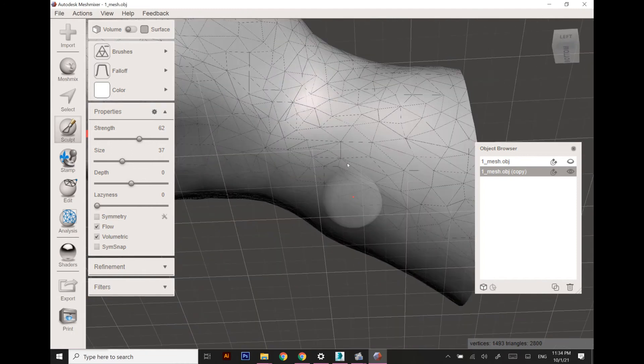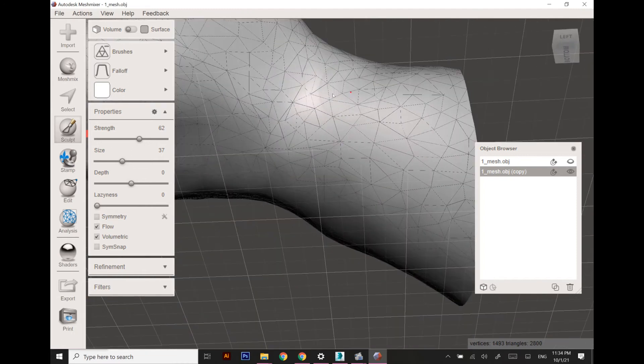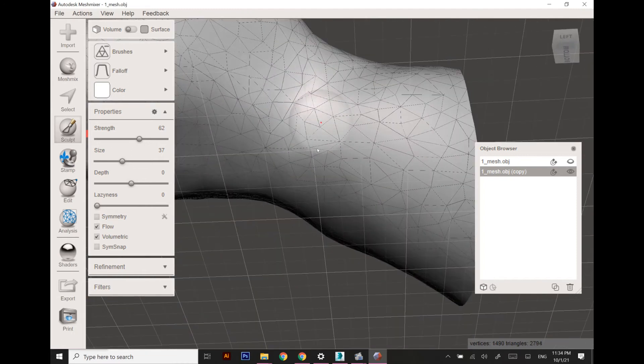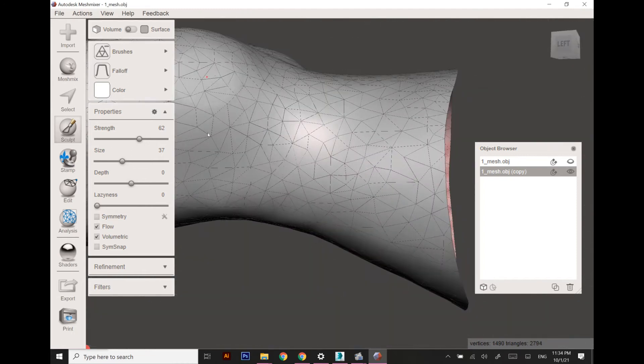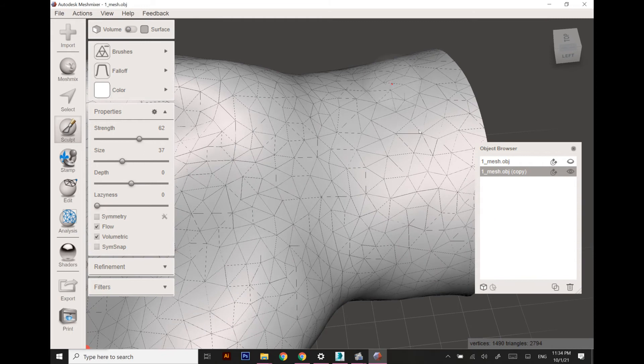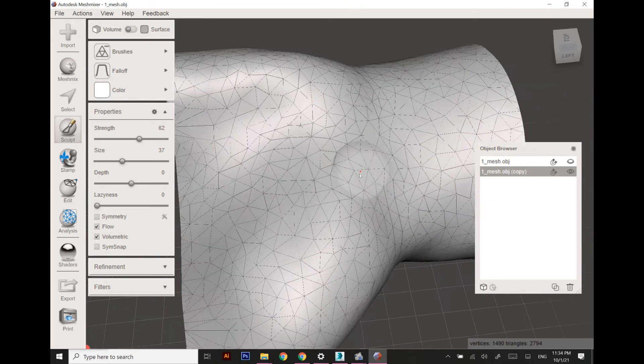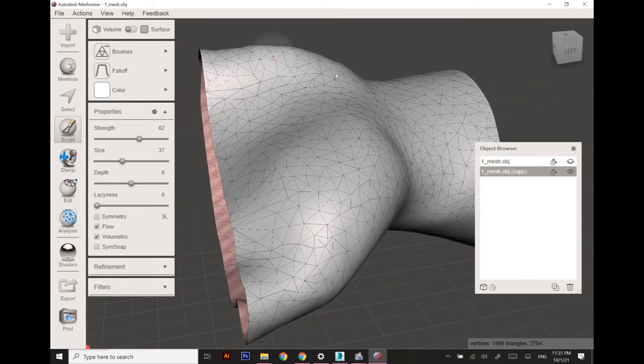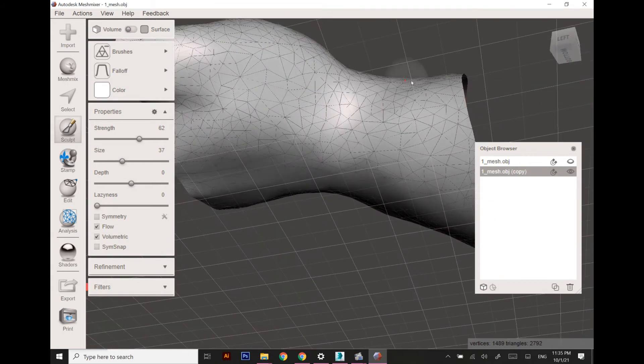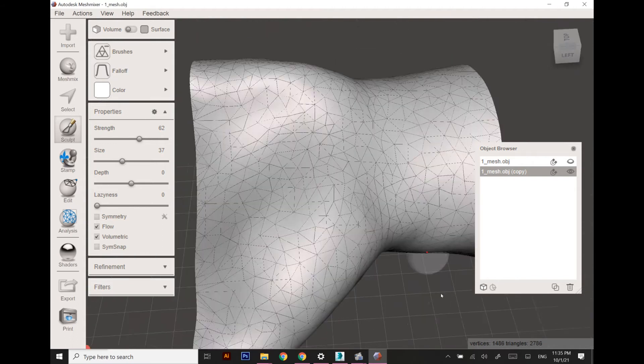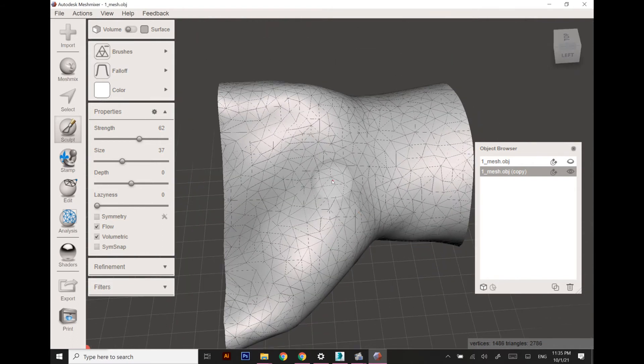Once the polygons are ready and I am satisfied with the patterns of the distribution of polygons, I'm going to apply the next command.